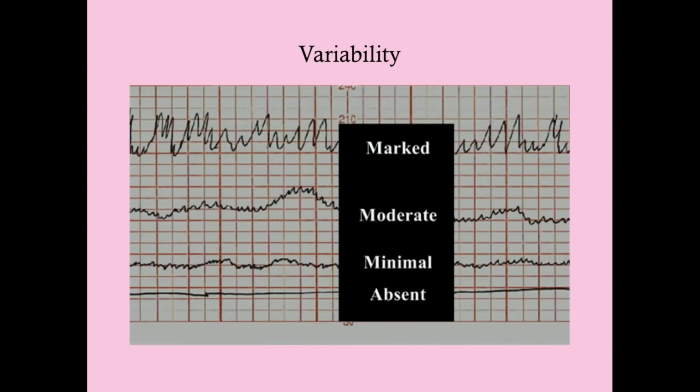Okay, so you can see here the difference. This is marked variability, so there's really no accelerations. If there are accelerations, they're going to be kind of covered up. But really, we don't see any discrete accelerations here, so you're going everywhere between, well, I think the author here just meant to demonstrate this, so we're not going to look at the heart rate, actually. Like they covered it up, too. So you can see moderate and minimal are pretty close together. Not much consequence there, though.